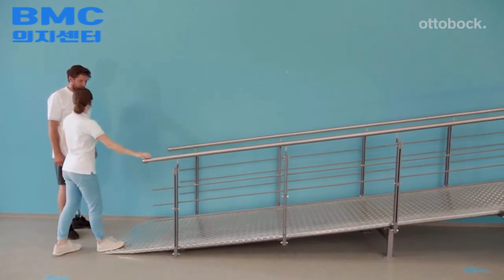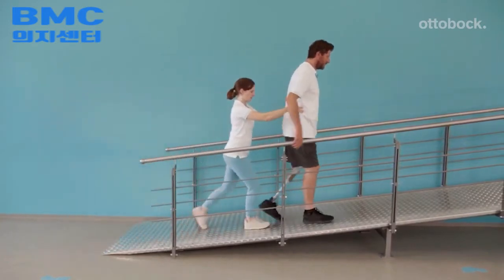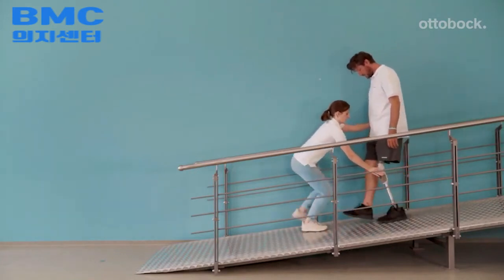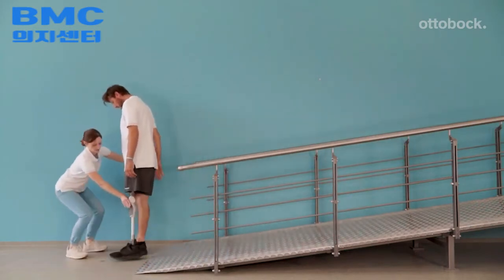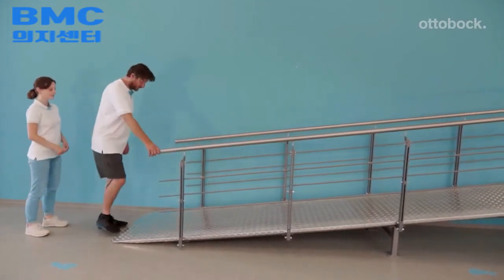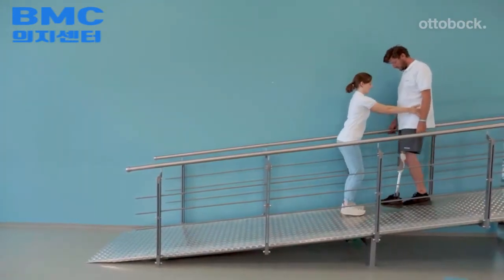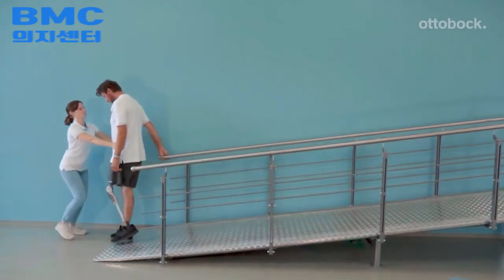The therapist makes sure the model does not circumduct or use a hip hiking motion. The yielding technique allows the model to walk down most slopes step over step, and his upper body stays upright during the entire movement. When walking down a slope, he starts with the prosthetic side first, keeps the residual limb relaxed, allows knee flexion, and rolls over the entire foot.